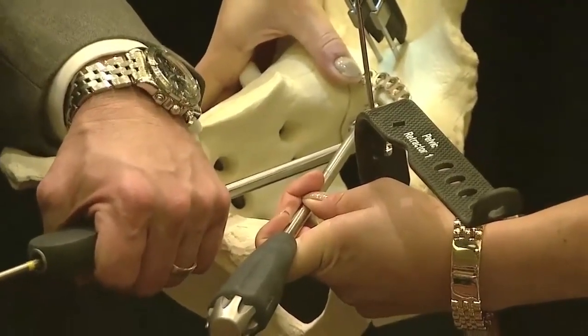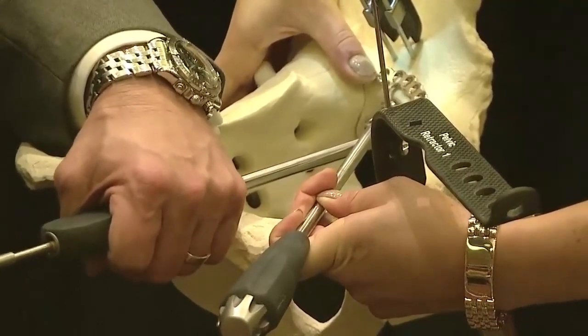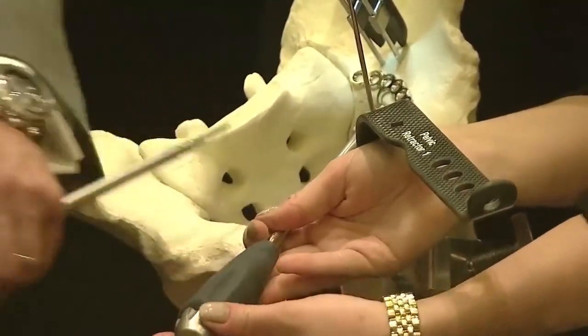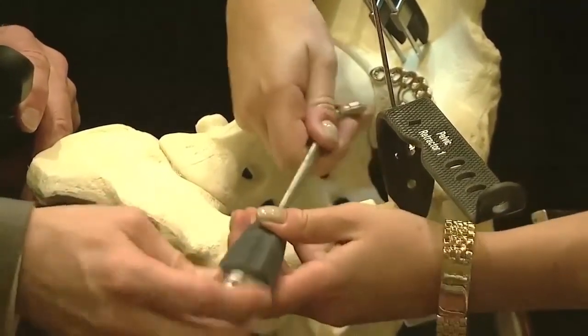And this is behind the acetabulum. So we'll just screw this down quickly, and I'll show you that'll hold the plate in position. You can see it's fitting very nicely to the quadrilateral surface. So now that's done, and then Karen will release, or I'll release the plate holder, and that'll bend out, can come out of our way.